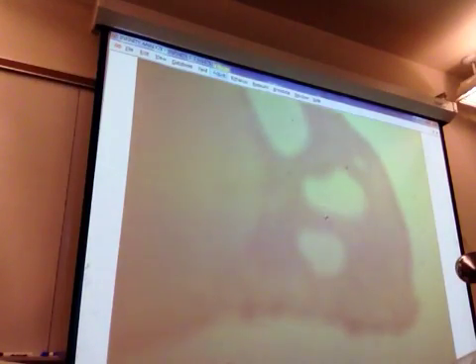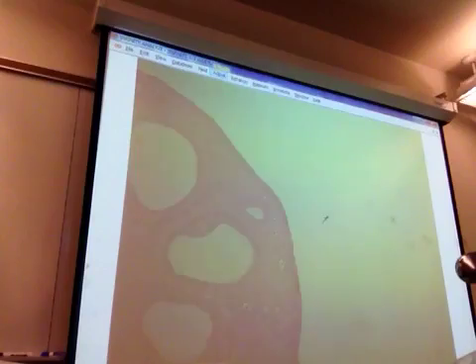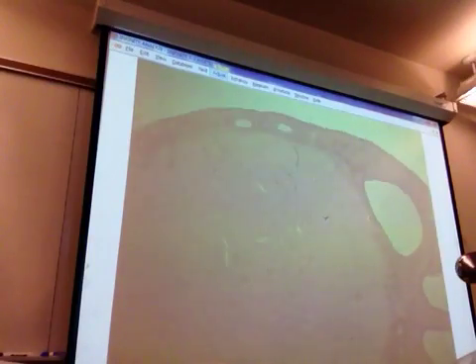I don't think it was entirely you, because I think that they do label it in some texts as that. So what is this, people? That's an ovary. What is the biggest thing on this ovary? Boom. Corpus luteum right there. That's the corpus luteum.